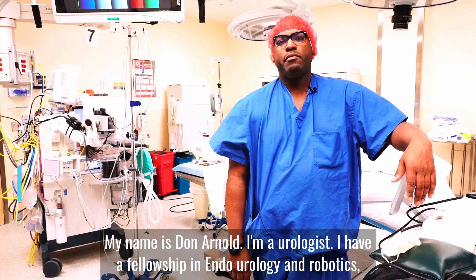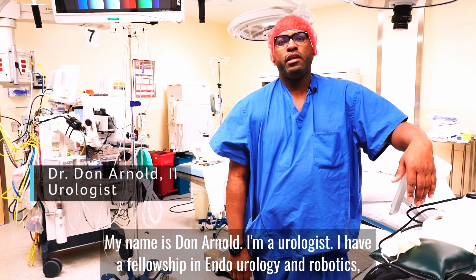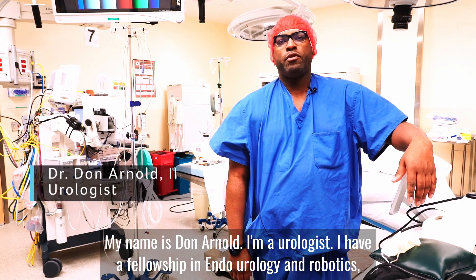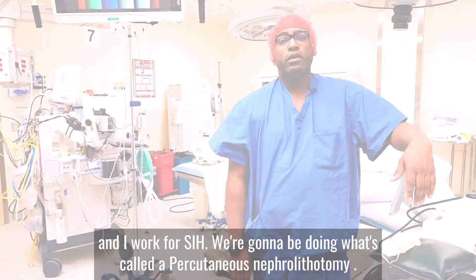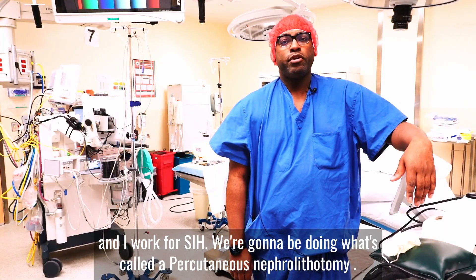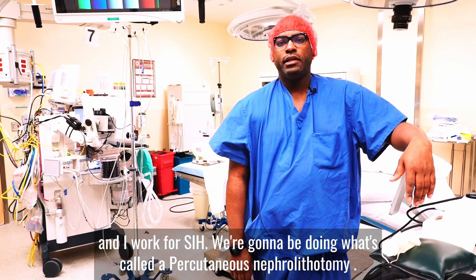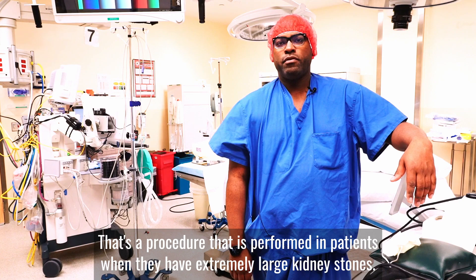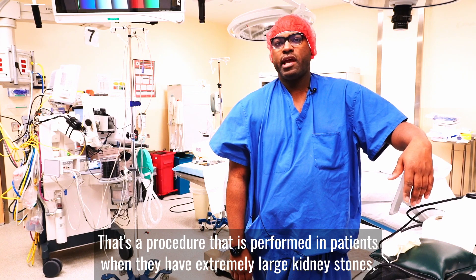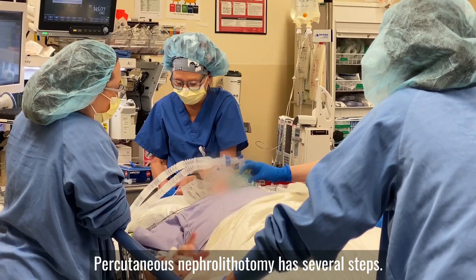My name is Don Arnold. I'm a urologist. I have a fellowship in endourology and robotics and I work for SIH. We're going to be doing what's called a percutaneous nephrolithotomy — a procedure that is performed in patients when they have extremely large kidney stones.